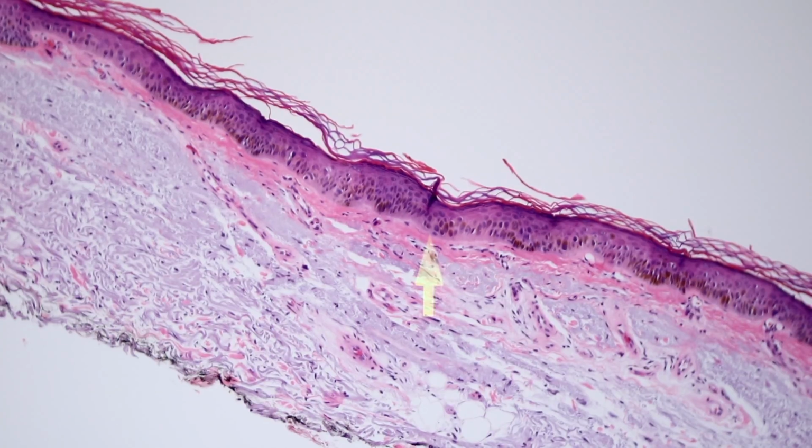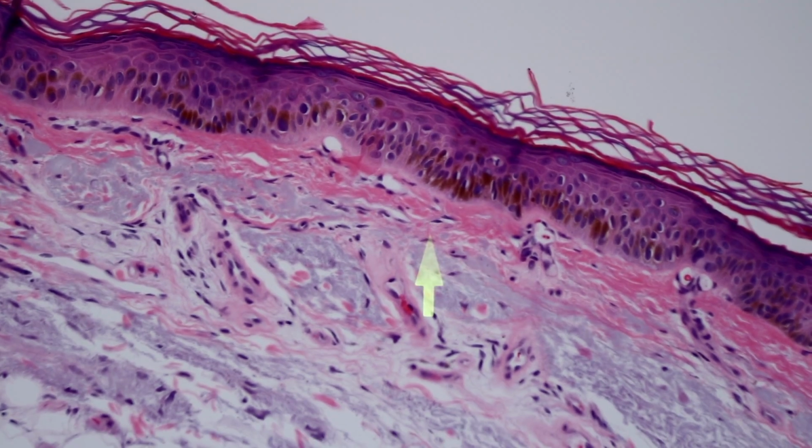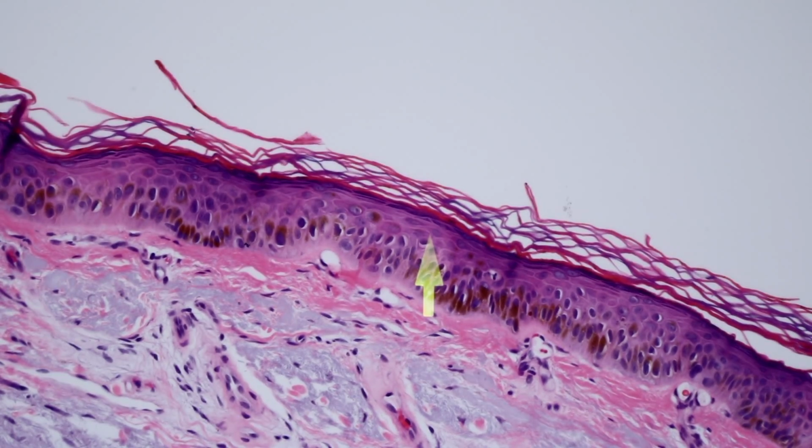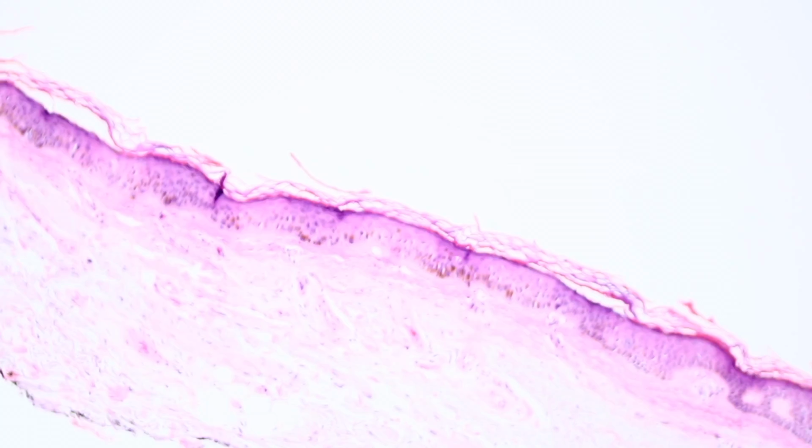And out here, look, we do have stuff that looks actually less atypical and much more like a regular solar lentigo, with, let me see if I can get it into focus here, increased melanin pigment in the basal layer keratinocytes. But then look, there's a couple atypical cells in here. So instead of having a bunch of angst over do I call this solar lentigo or pigmented AK, oftentimes what I use for these personally in my practice is I say pigmented actinic keratosis and solar lentigo, and I use that as my line diagnosis in the report because they often intermingle together.